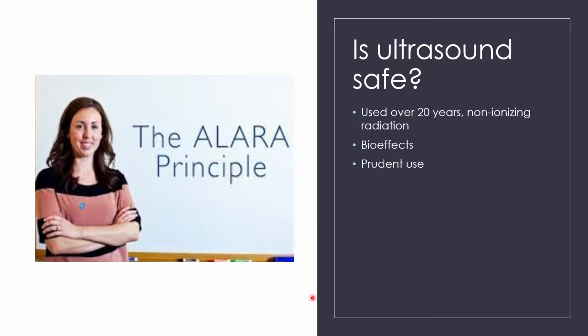Now, we know in the Pregnancy Resource Center, it's not about keepsake videos, it's not the 3D. We're trying to show these clients what's actually there. We're trying to show them that it is a little tiny human. There is a heartbeat there. It is moving around. It's got arms, it's got legs. Those are the things that we're trying to show.